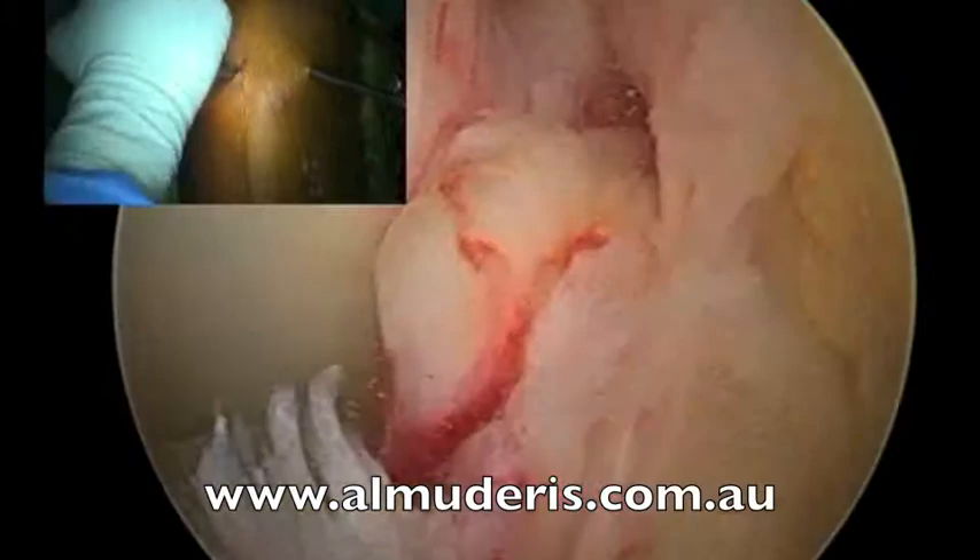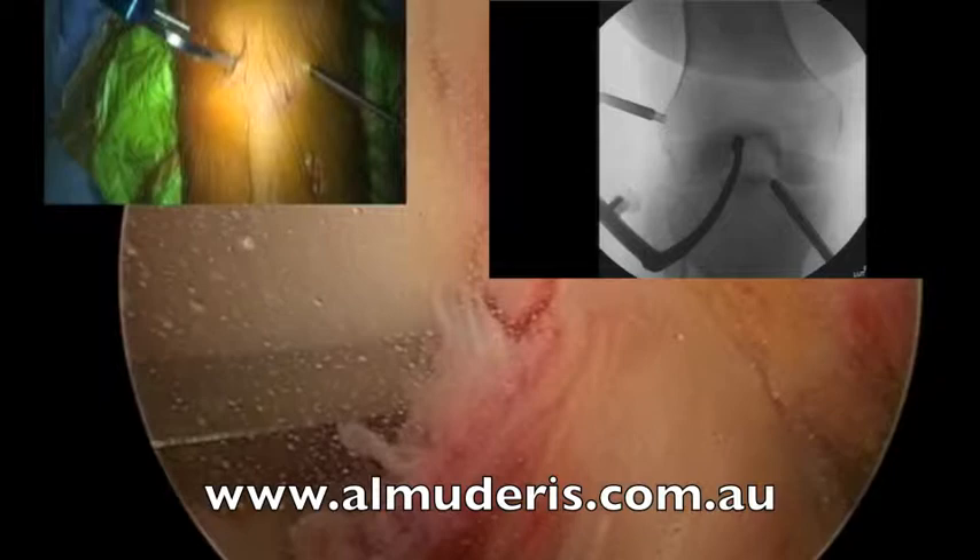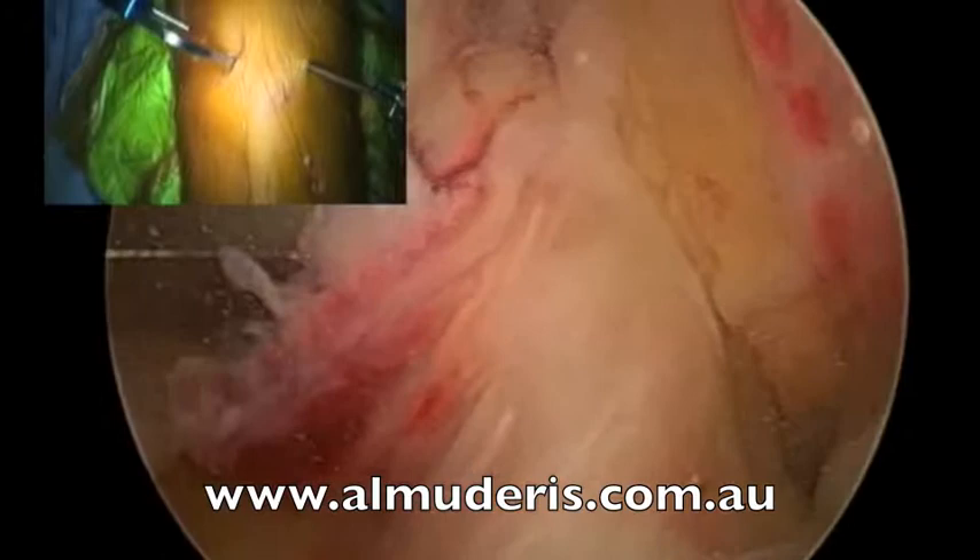I insert the femoral jig and do an x-ray in the AP position. Through a stab incision, I make the entry portal for the flip cutter on the femoral side. X-ray everybody. Save this one. That is perfect — I am happy with this position.